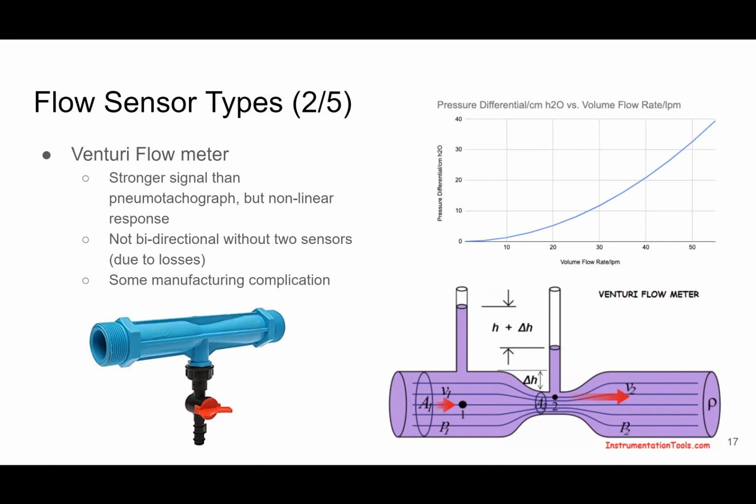So those were like similarly sized venturis. And then just in the bottom left is a picture of a gardening venturi that we'd used on a different project, which is, at least to a first order, sized almost exactly right for what we're trying to do here. So we have used a 3D printed part, but the nice thing is these are kind of cheap injection molded $4 parts if that ended up being the right sizing. Next slide.